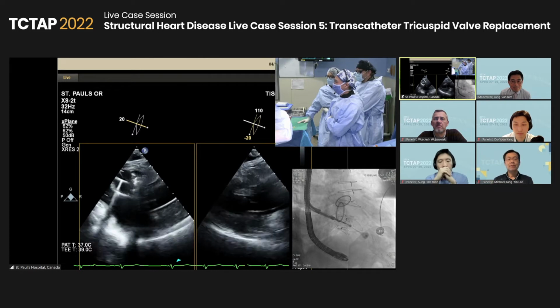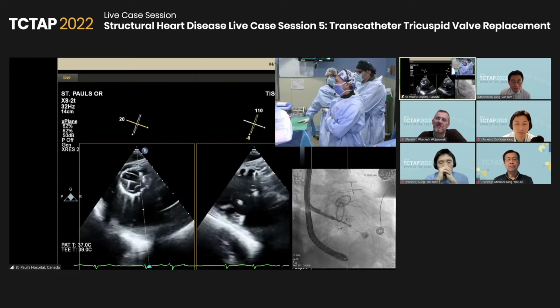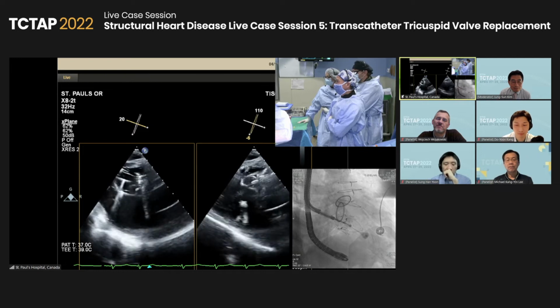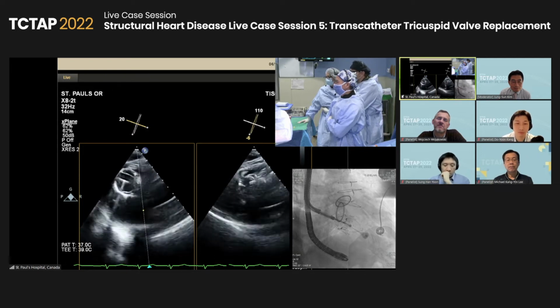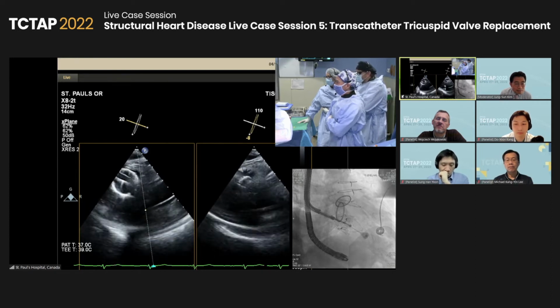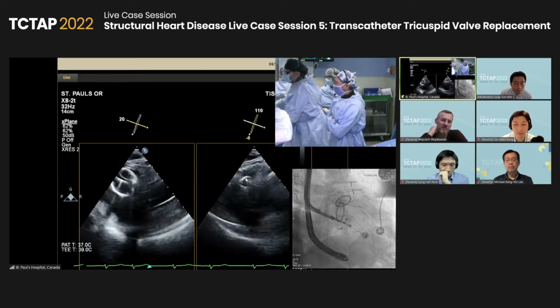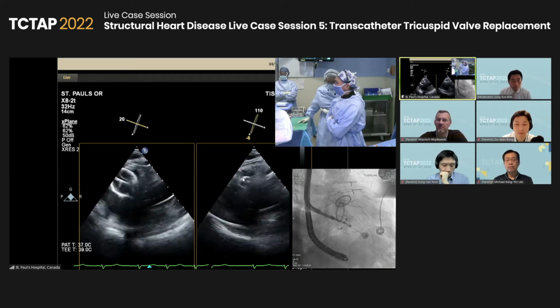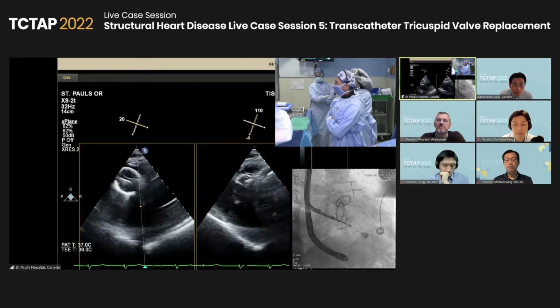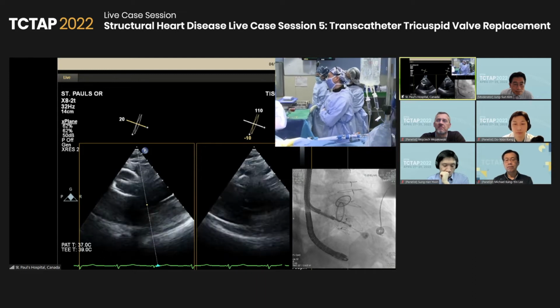I'm seeing the septum, but it's there, right? That's where the septal tongue should be on that right-hand image, because I'm steering away from the valve. So can you see that there, Anson? Can you put a cursor on it, so tell me what you think there? I think that this is the septum here. And he's put the X plane through it. I'm putting the X plane through where the septum and the valve are close together.